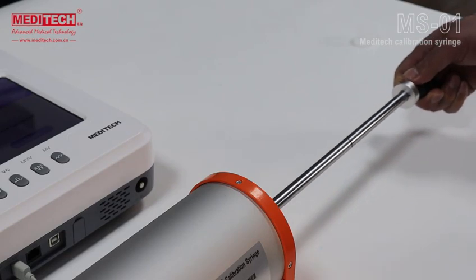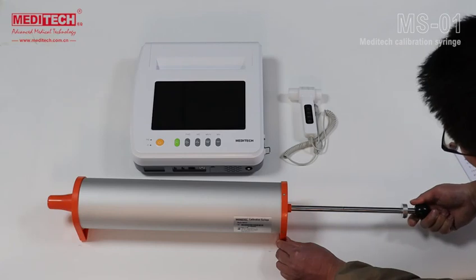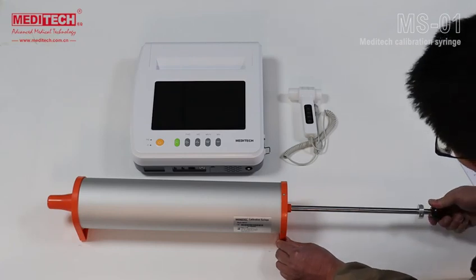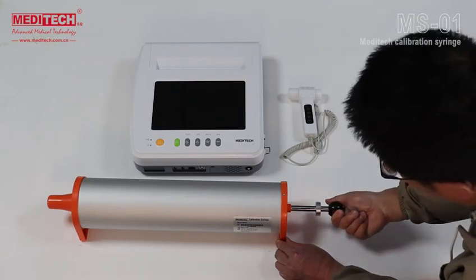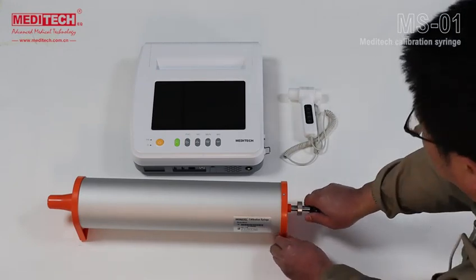Turn the handle clockwise or anticlockwise when pushing and pulling. Carry out the push-pull process in three cycles for calibration. The first cycle is at low speed, about 3 to 5 seconds.